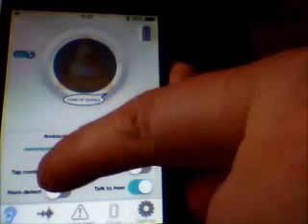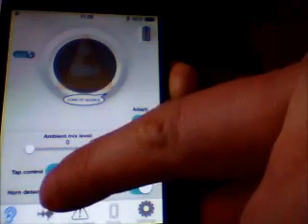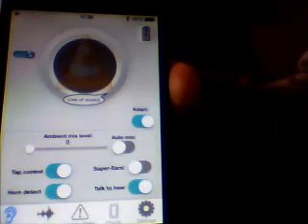Now the tap control here sends a BTLE command to enable or disable the tap system. When enabled, this system detects a manual user finger tap on the earphone, which then mutes music playback and passes through ambient sound. The horn detect switch sends a BTLE command to enable or disable the horn detection algorithm system running on the earphone hardware.